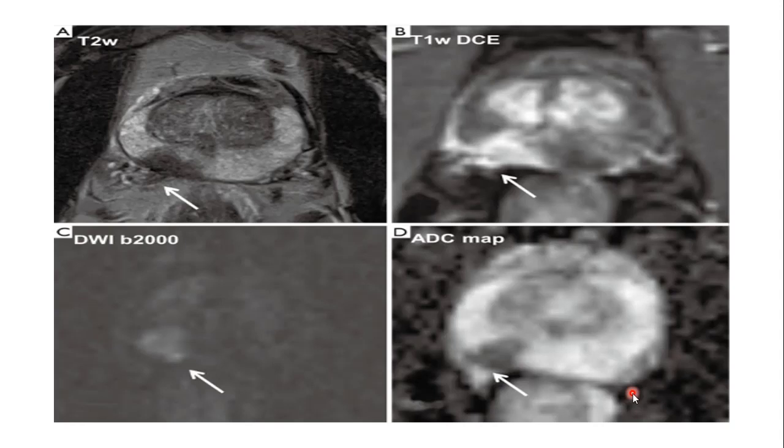So the diagnosis of prostate cancer, initially, when there was no MRI, TRUS or certain other things, was clinical, and the TNM staging was made on clinical grounds, on the DRE, up to clinical stage like T2c, whether both lobes were involved on the DRE or not.